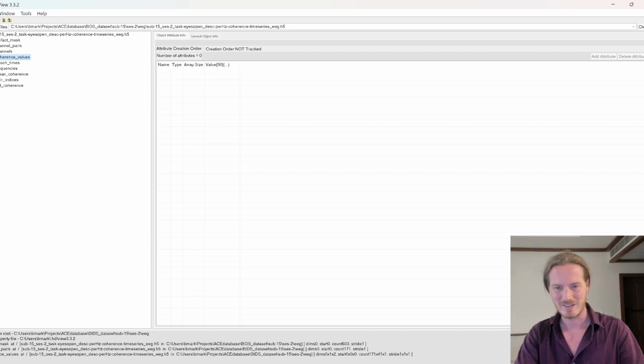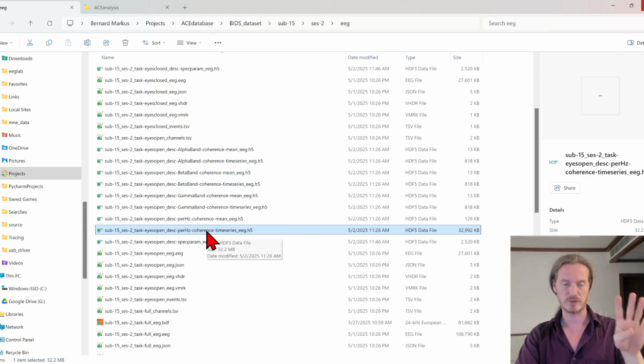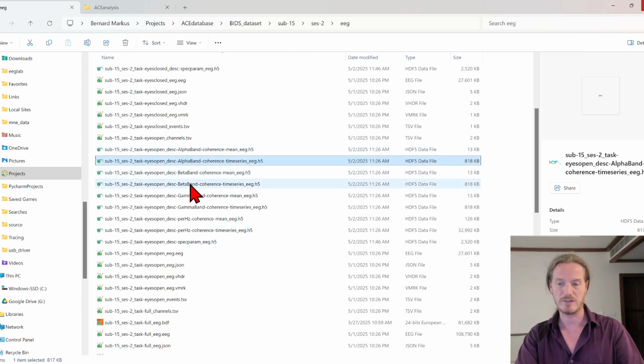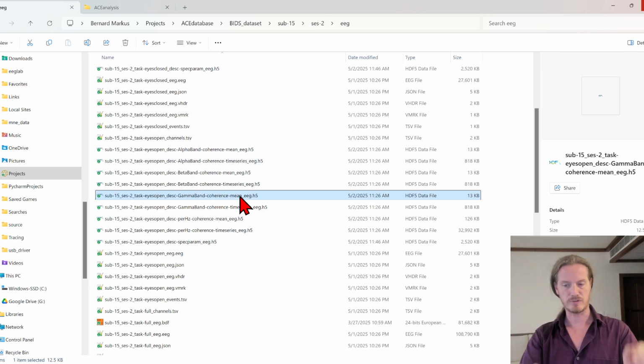That would be silly. However, so I'm going to close this again. That is exactly what our other program does. So we have the data, it is sitting there in the database, and it is sitting there for every individual frequency. It sits there also pre-calculated just for alpha and for beta and for gamma. So we don't have to average those ranges. And we have the time series, but we also have the value over the whole time span.